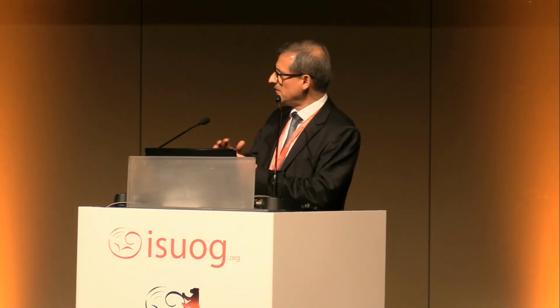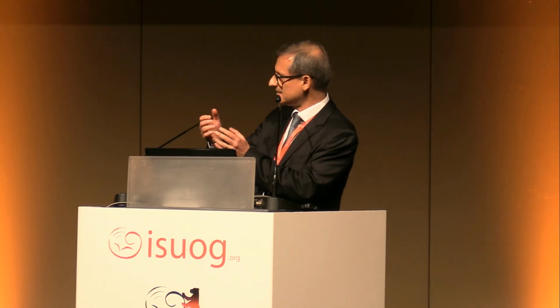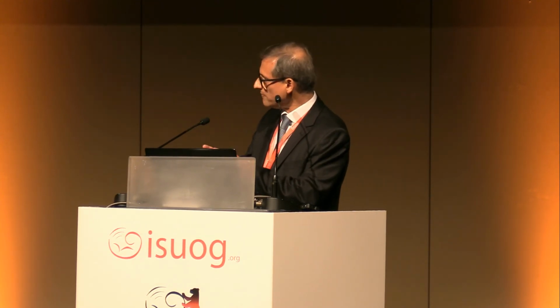Thank you. Any more question? I have a quick question. How do you manage to perform the registration between the ultrasound and the MRI images? For registration, we have a software. We have the polygons, it takes some small pieces from the ultrasound and put in MRI. So just small, but the quality of MRI now is getting better and better. As time passes, I use this less. I used it much more before.